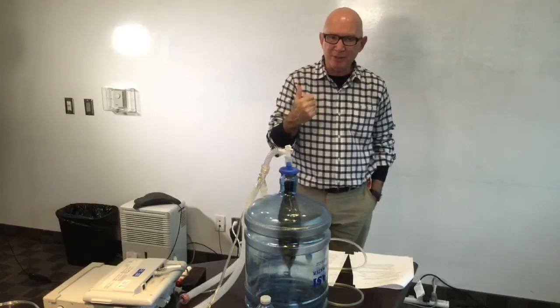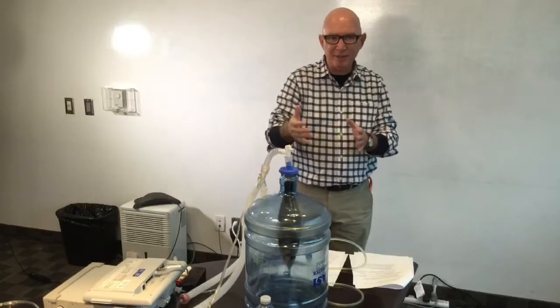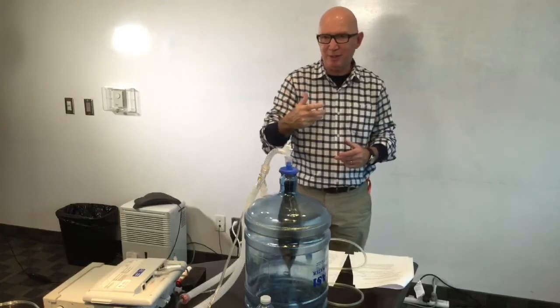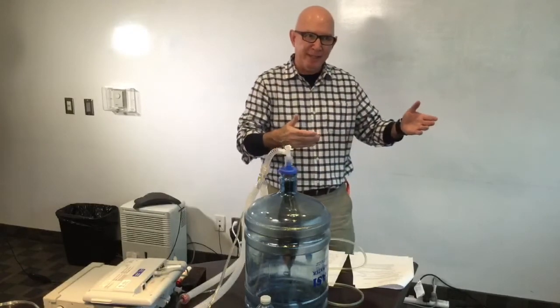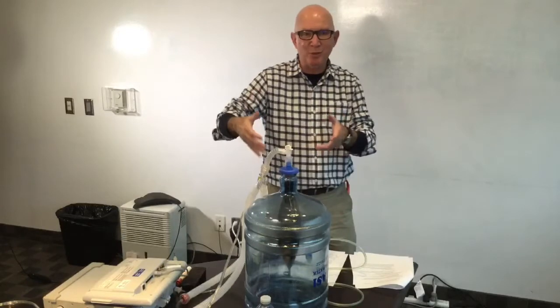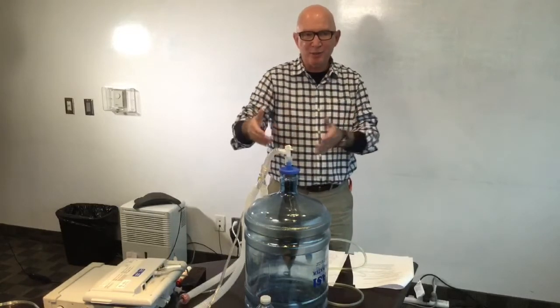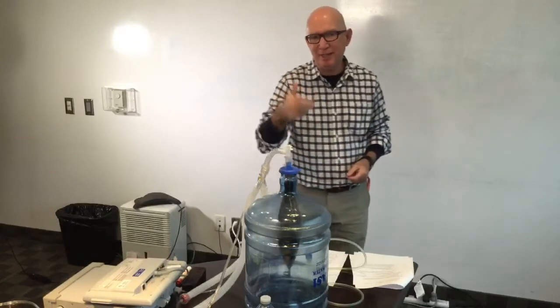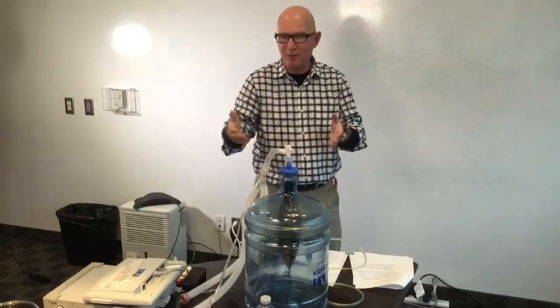The other thing about this too is that when individuals talk about breath stacking when it comes to SIMV, they've talked about, well, there's smaller volumes with the spontaneous breath. Well, the thing is, if the patient's taking those spontaneous breaths and there is a real physiologic reason why they're doing that, so it's not because they're in pain or they're anxious, then that tidal volume that they generate on that spontaneous breath should also be 6 to 8 mils per kilogram ideal body weight.